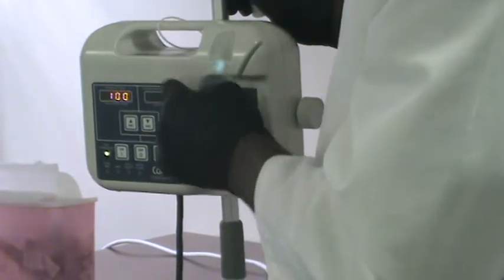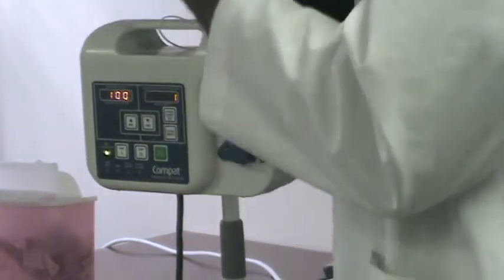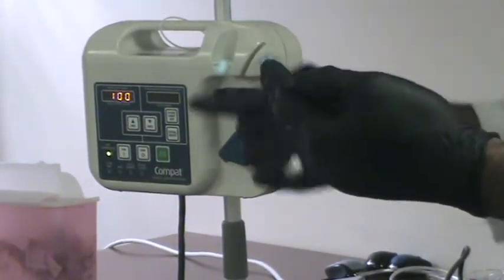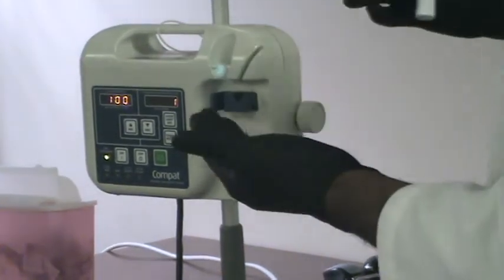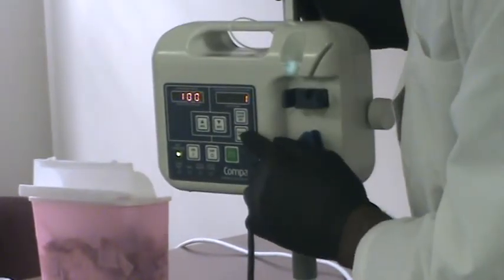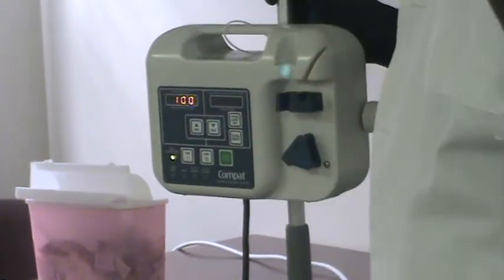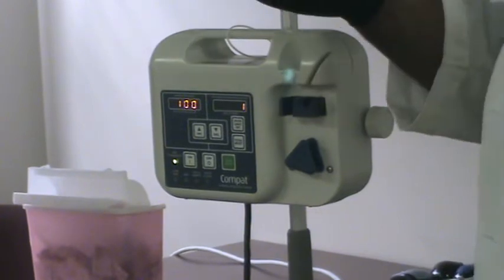So this window also shows you, once you start the feeding, what she's getting so far. If you start the feeding at 4, it will start counting. Before you start the feeding, you have to reset. Let's assume 1,000 was here from yesterday's feeding, which ended at 2 a.m. and she was done from yesterday.